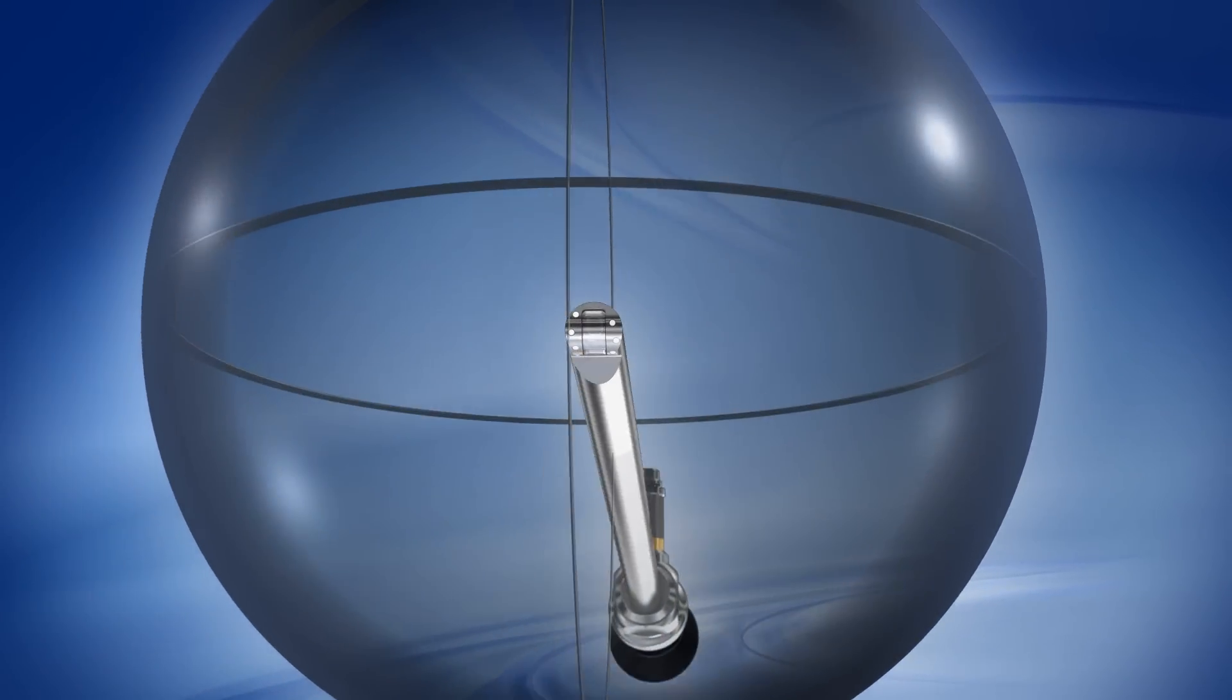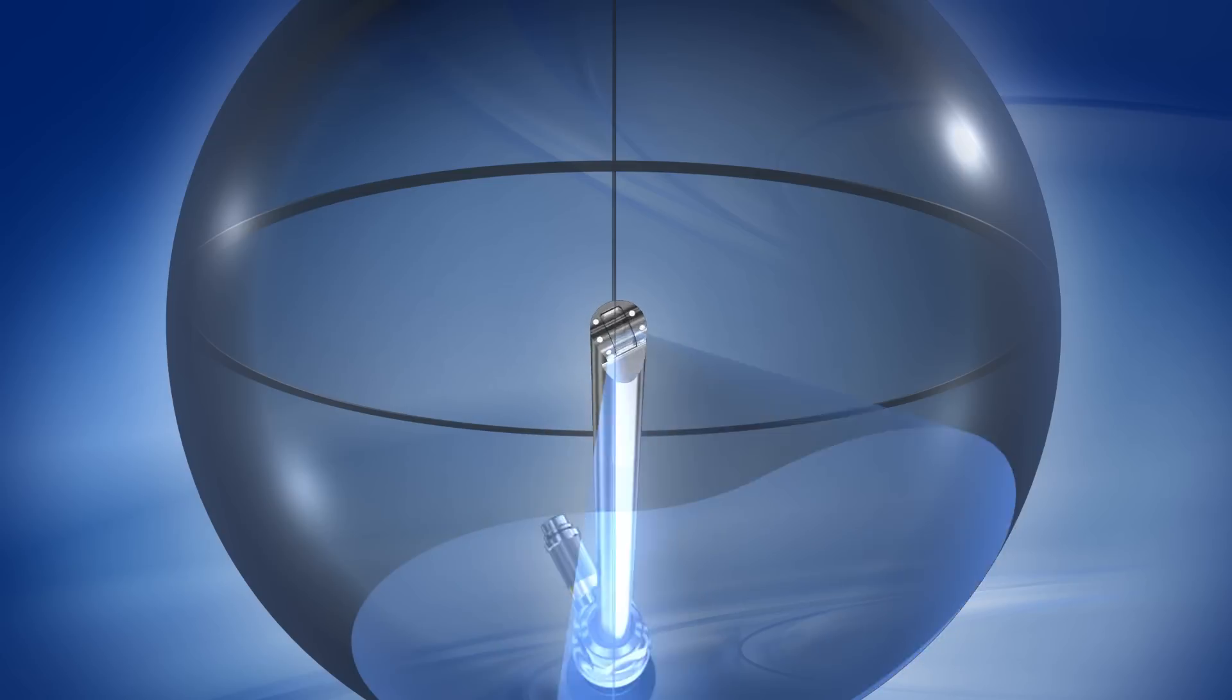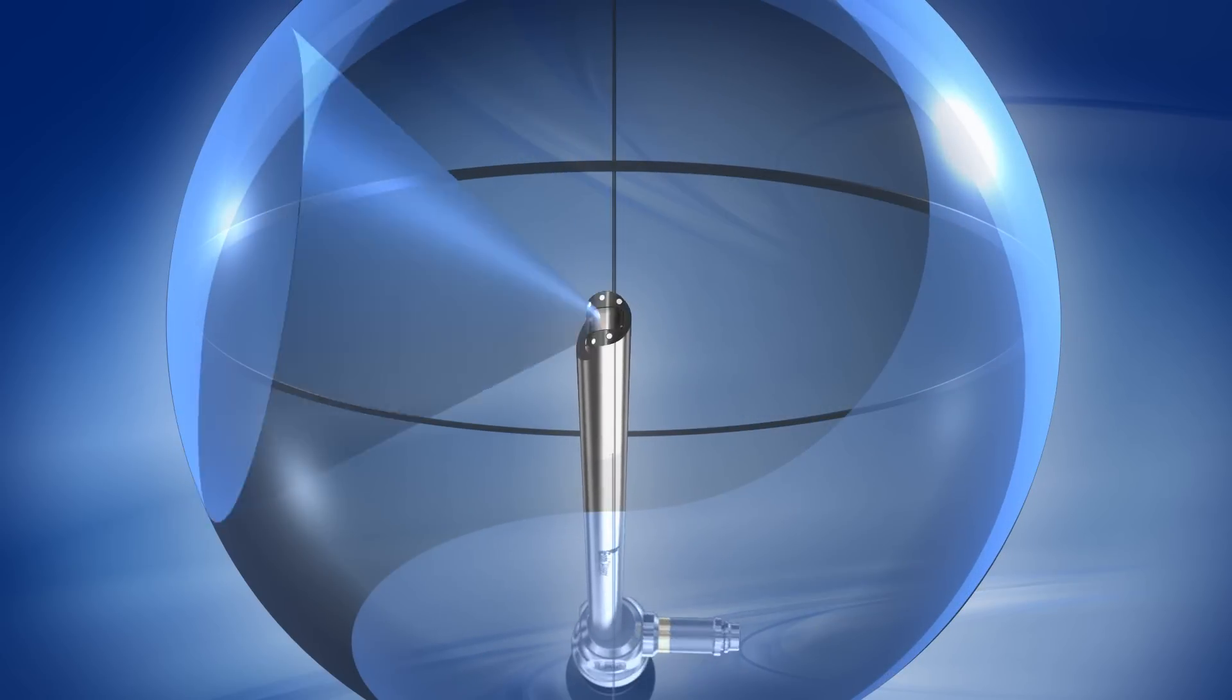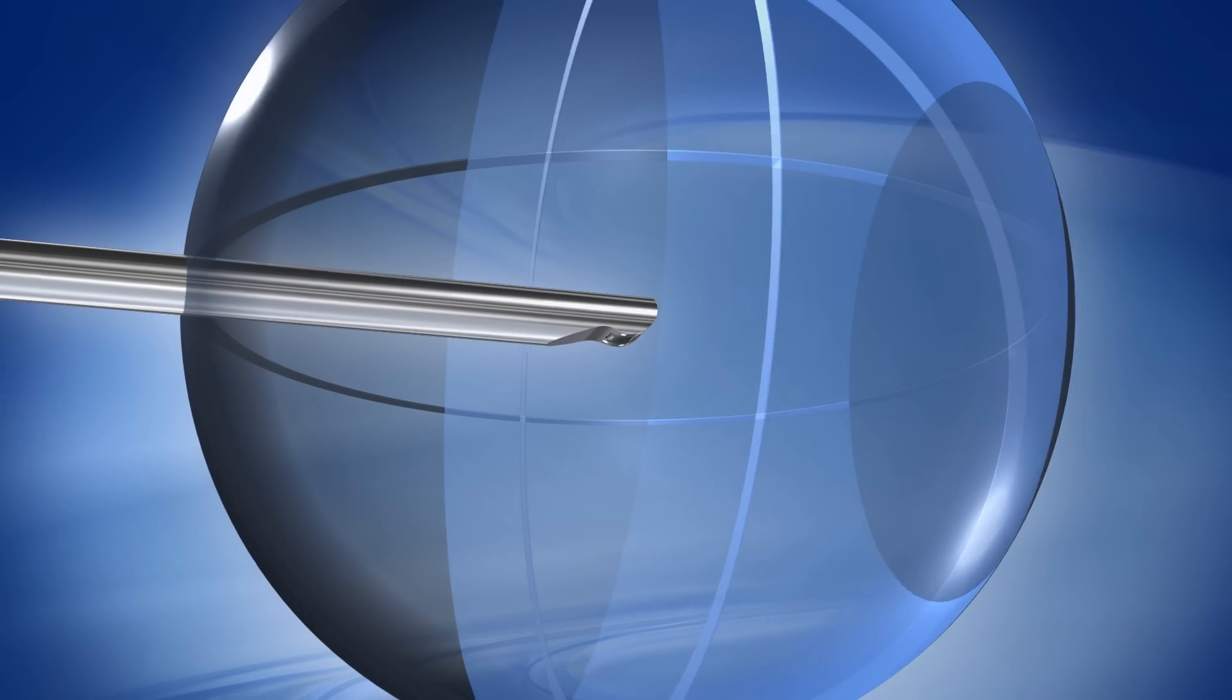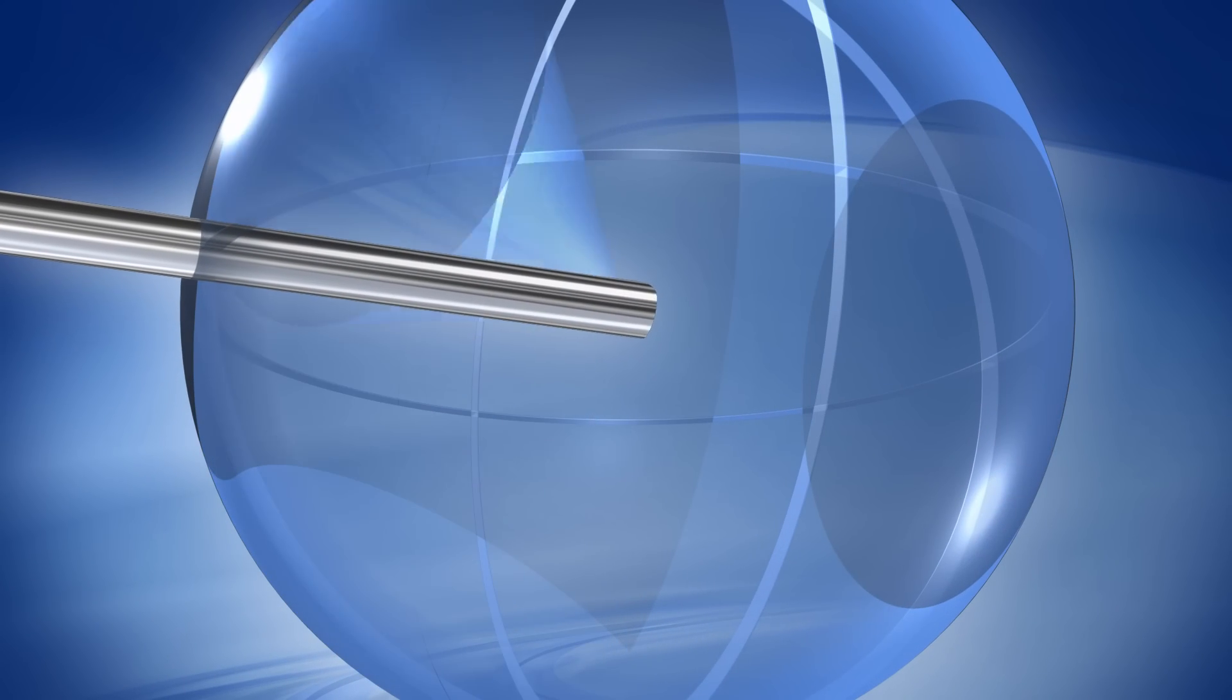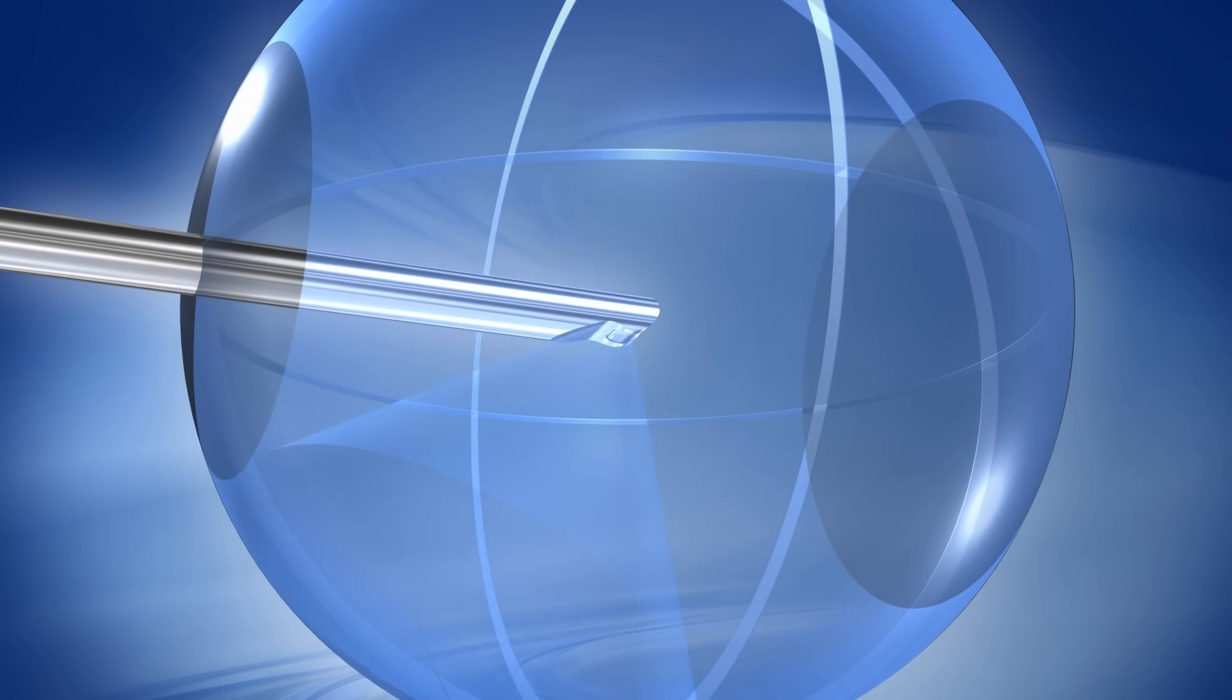The possibility of rotation allows the field of vision to be expanded in any direction, and makes the EndoChameleon a perfect all-round vision laparoscope with the well-known advantages of rigid Hopkins rod lens technology.